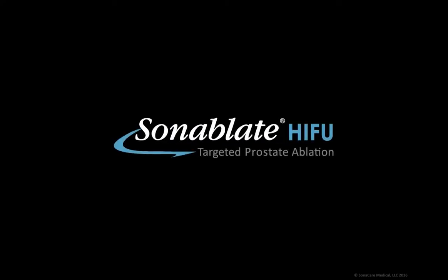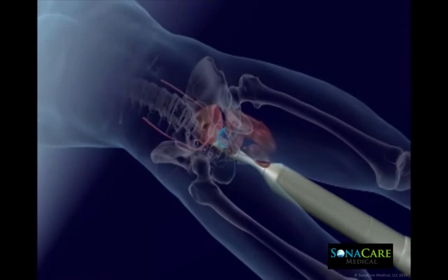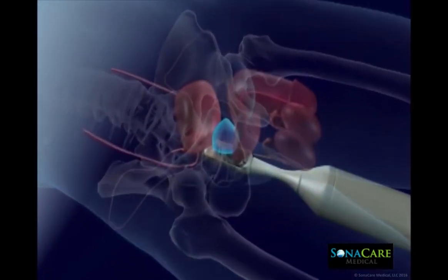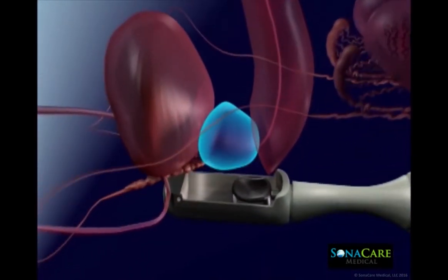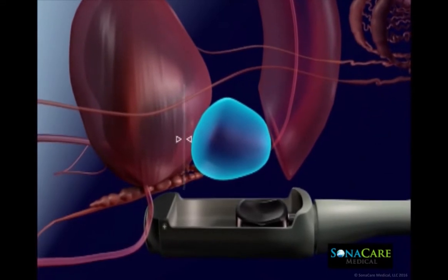The Sonablate system is a physician-guided robotic device that is FDA cleared for transrectal high-intensity focused ultrasound ablation of prostatic tissue. HIFU is delivered via a transrectal probe that is securely positioned in the appropriate anatomical orientation at the beginning of the procedure.